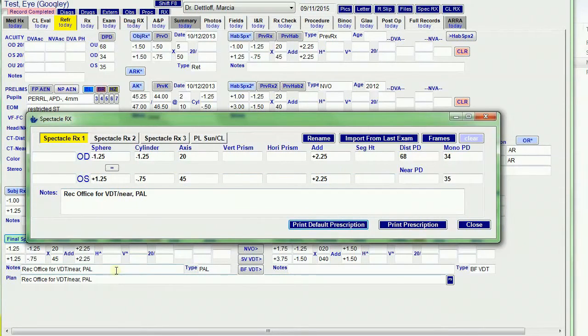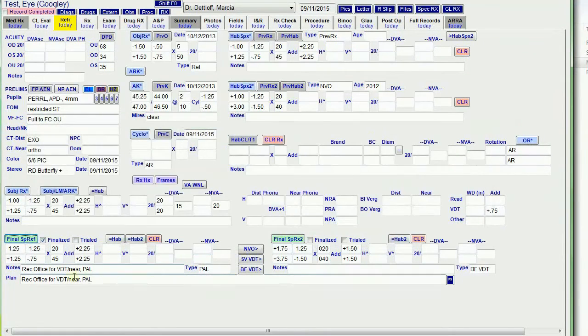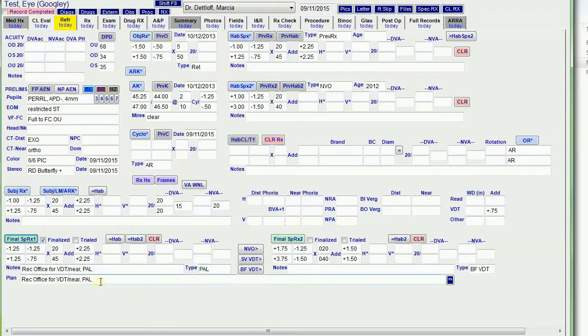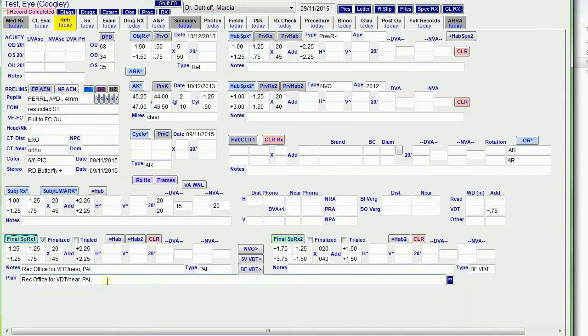It puts the notes that are in here in the note field. I can change them if I want or delete it. Then it copies the notes and the type and puts it in this plan. And it looks kind of funny because it's almost the same as what's up here. But this plan is also in the plan field on the A&P tab.